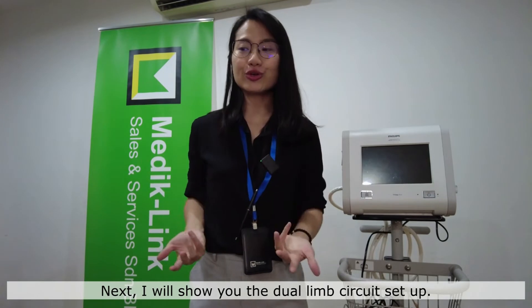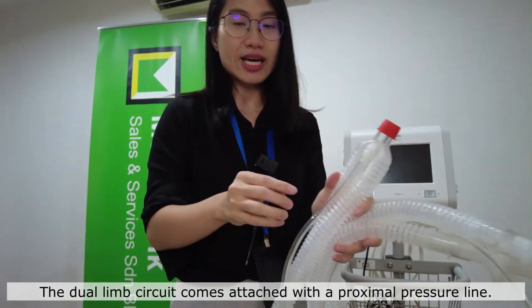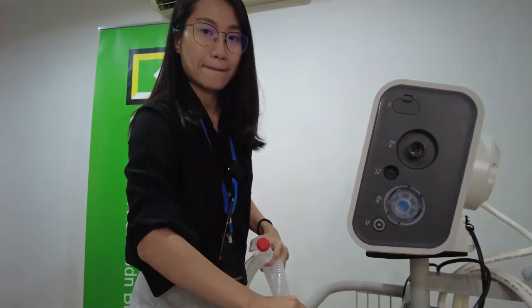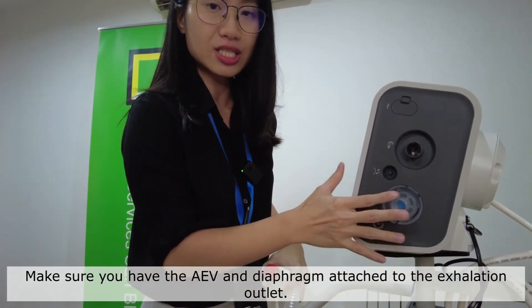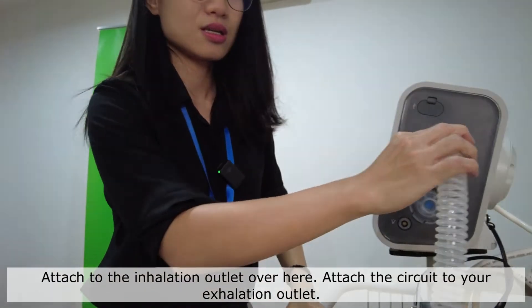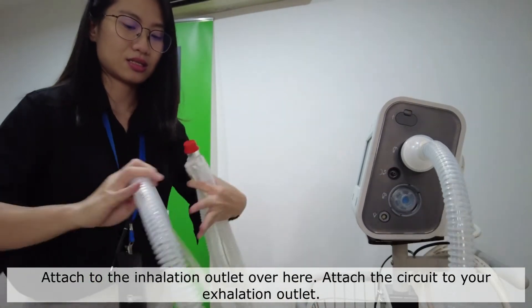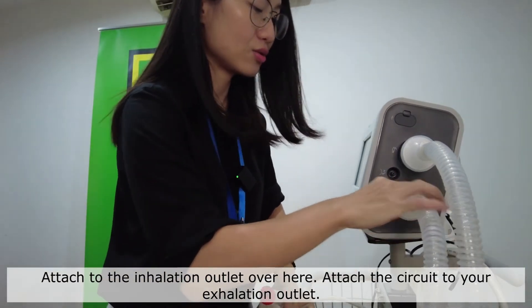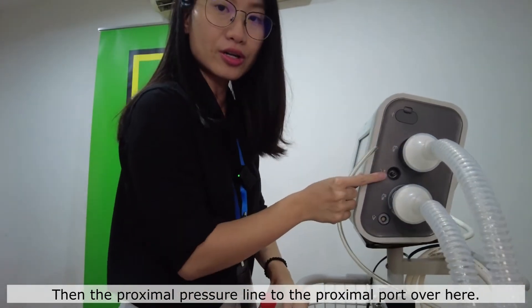Next, I will show you the dual limb circuit setup. The dual limb circuit comes attached together with the Proxima pressure line. Make sure you have an AEV as well as a diaphragm attached to the exhalation outlet. Attach the inhalation outlet, the circuit to your exhalation outlet, and also attach the Proxima pressure line to the Proxima port.